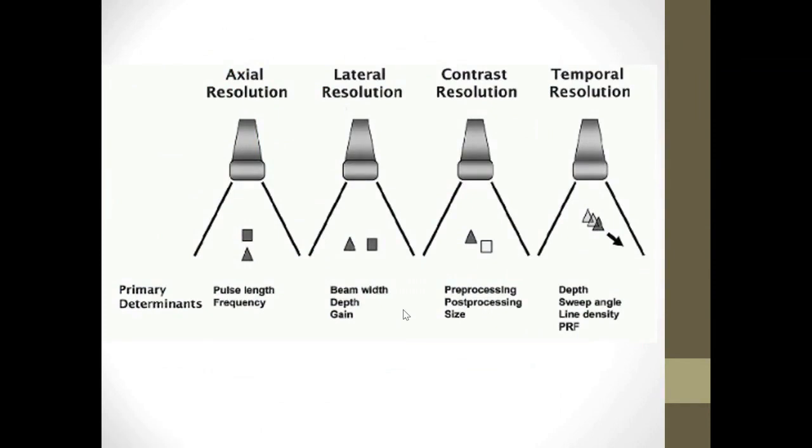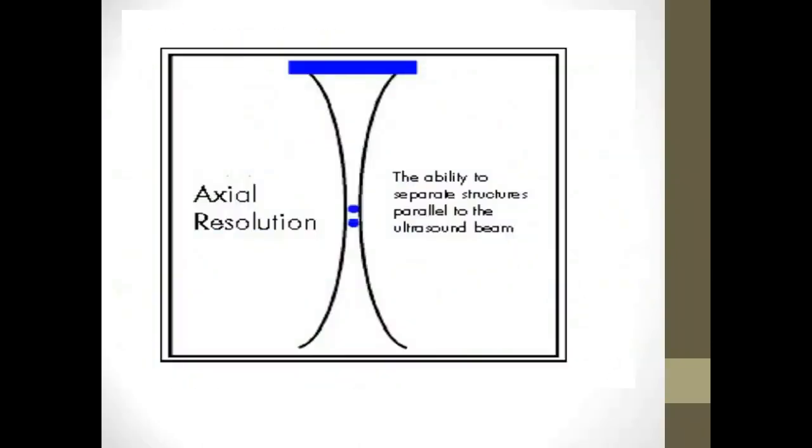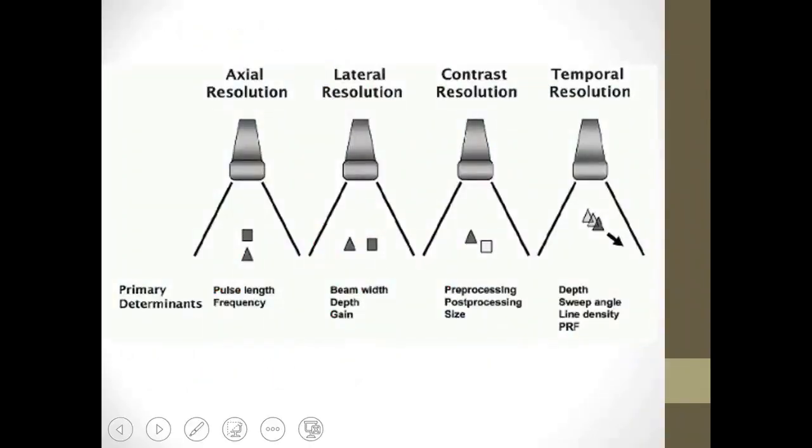Hello everyone. I have two important things to discuss. First, the frequency I am working with is a very important parameter in resolution. Right now, I have two objects inside the patient or inside the organ I am imaging. These objects could be positioned one behind the other, meaning they are on the same line. Then, I have two other objects that are next to each other. Now, I want to differentiate between the objects that are behind each other. How can I do that?